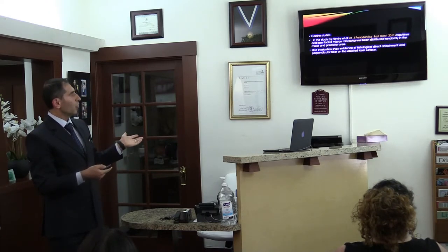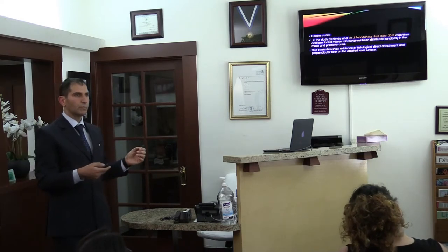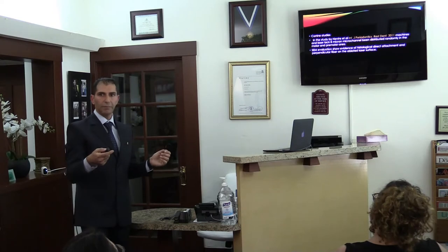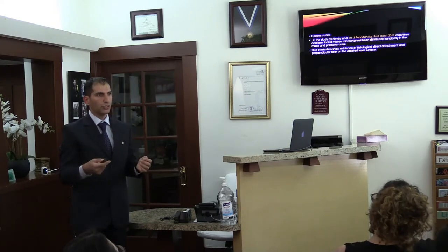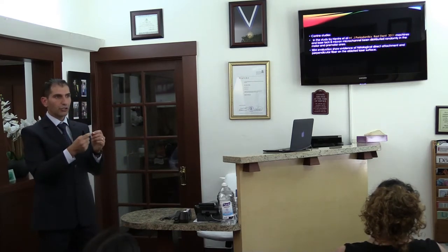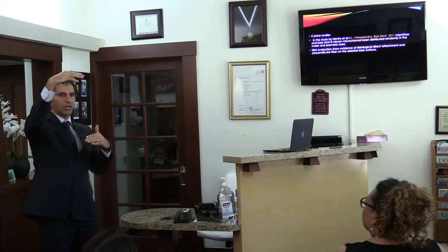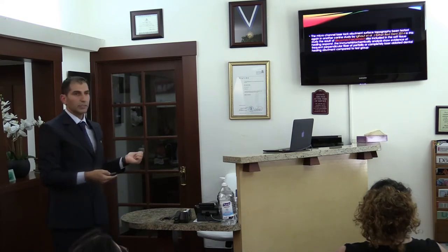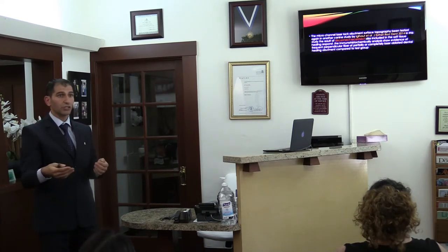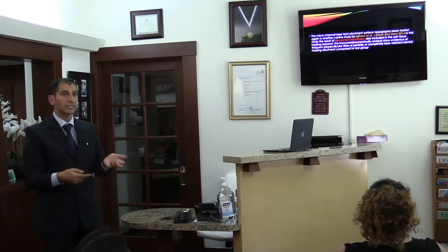I think you all have heard about this, and I think this is great. Another study by Nevins et al. was published about BioHorizons and the Laser-Lok implant. Now, the Laser-Lok ablated surface has been applied to the dental abutment. If you work with a surgeon or place BioHorizons, you might know about this, but they have micro channels of 8 micron height roughness between the mountain and the valley. And they got a great result too. They have a great seal, and they have perpendicular insertion. They apply that first to the implant, and they get a great result on the bone and integration. Then they even apply it on the abutment as well, so you can utilize it on the abutment.